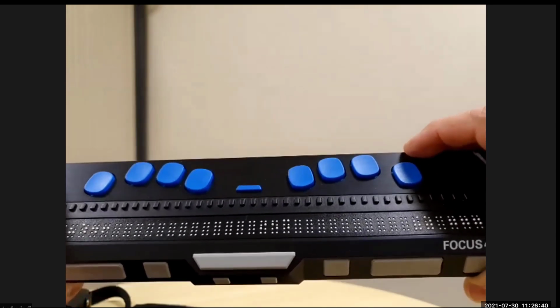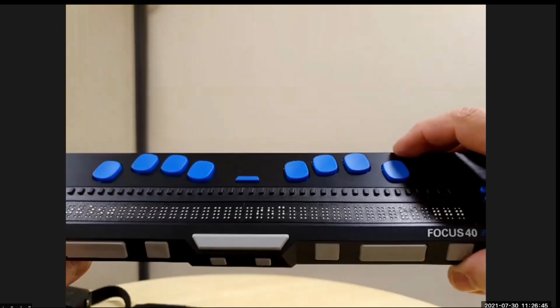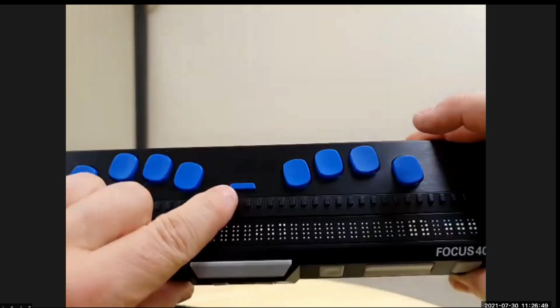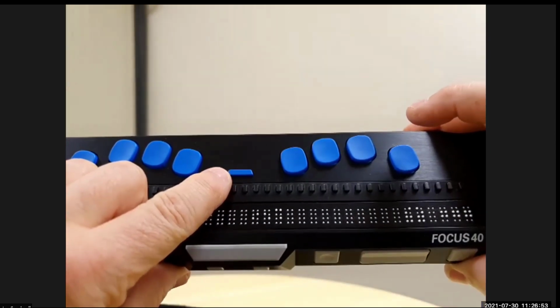We'll explain a little bit of that shortly, and Damian will also go through some of that as well. Now, in between dots 1 and 4, you have a small rectangular key, which is the menu key. And that does a couple of things with the Braille display just standalone.